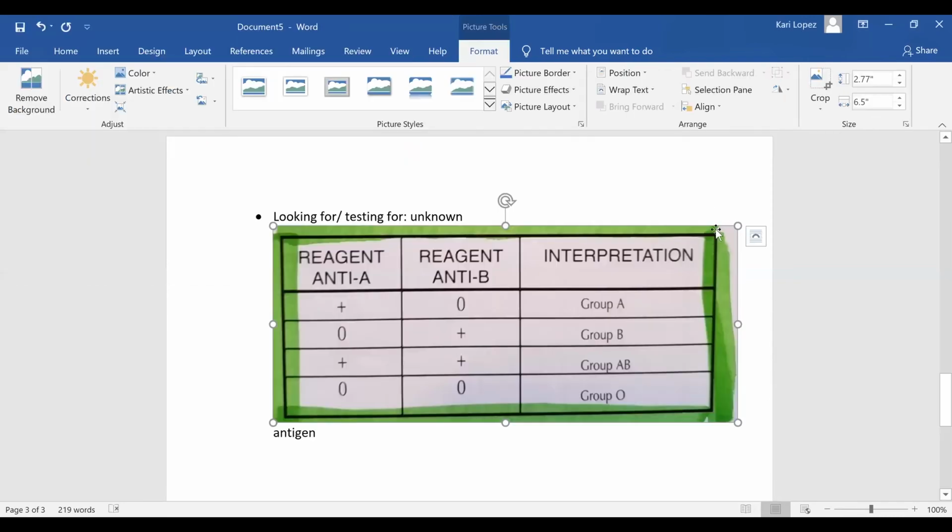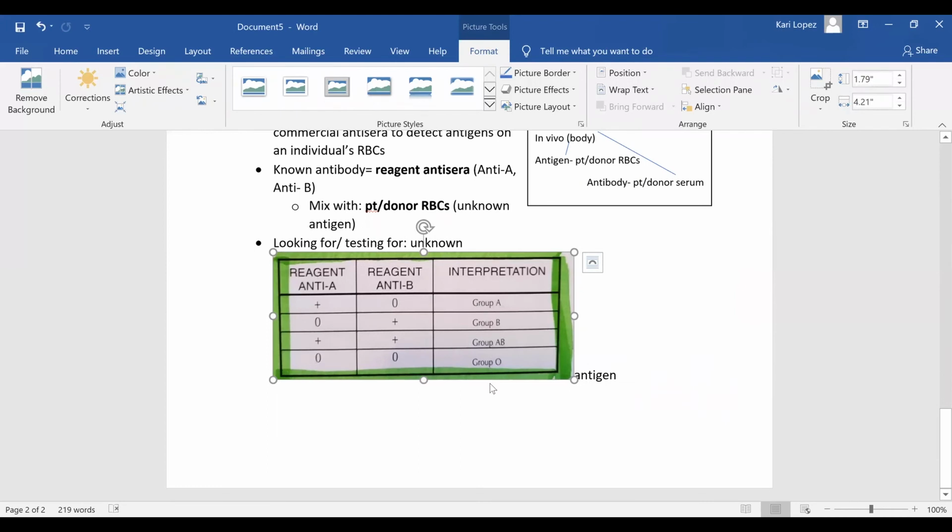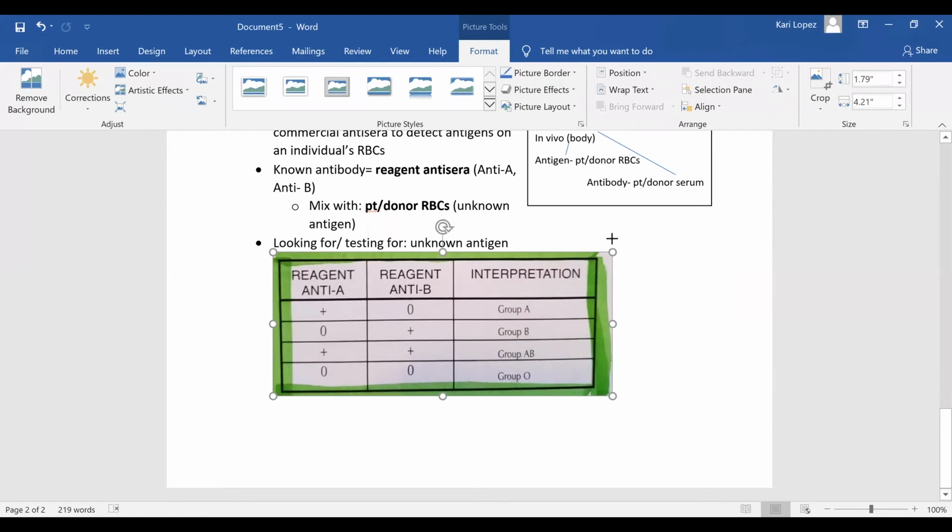The forward is pretty straightforward and rather easy. It is going to follow exactly what your results are, which is always nice.